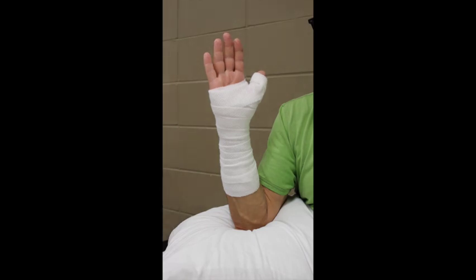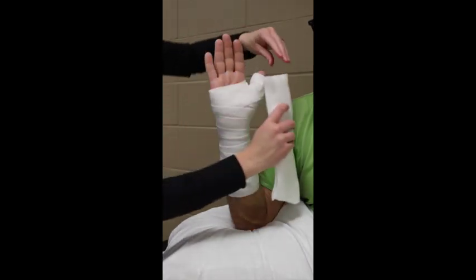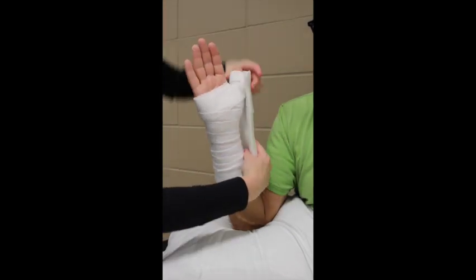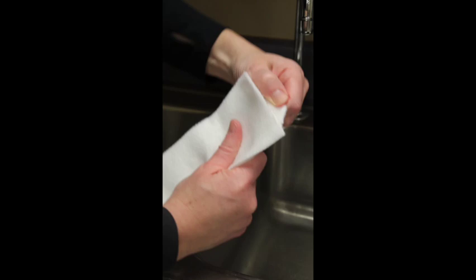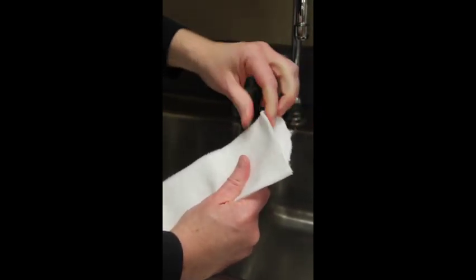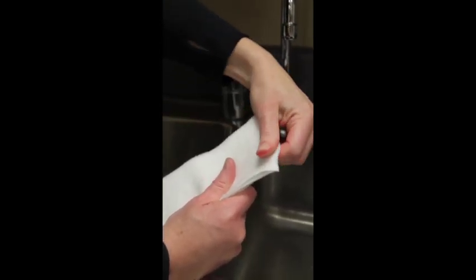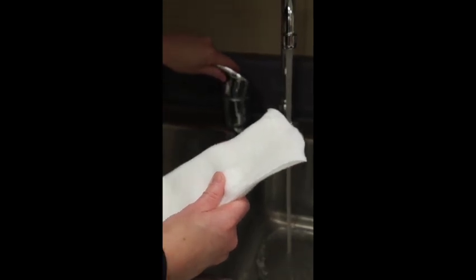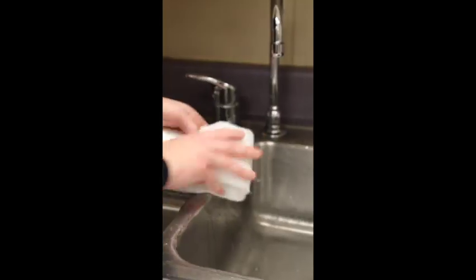To apply the splint, take it out of its packaging and apply it to the radial aspect of the forearm, wrist, and thumb, measuring just inside the padding at both ends. It is very important to pull the edges of the padding over the fiberglass at both ends before you get it wet. Then get the splint wet using room temperature to cold water, which will help it set up fast.